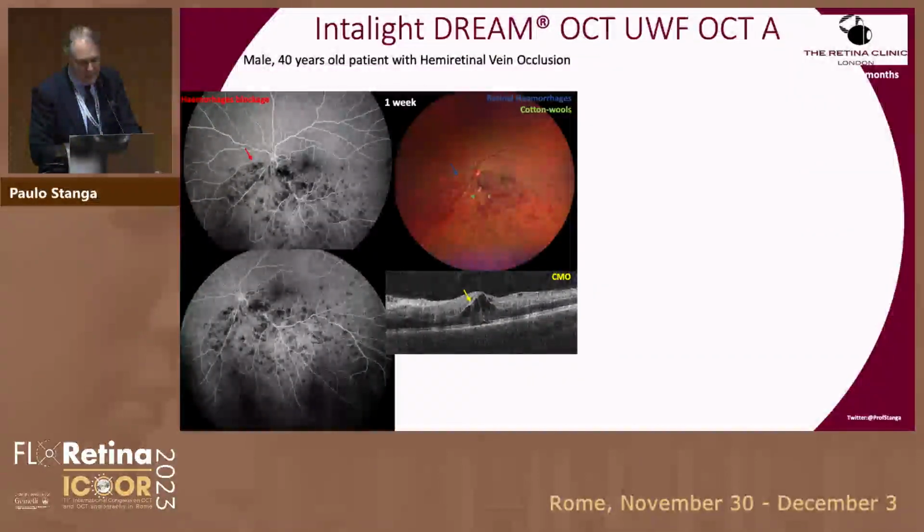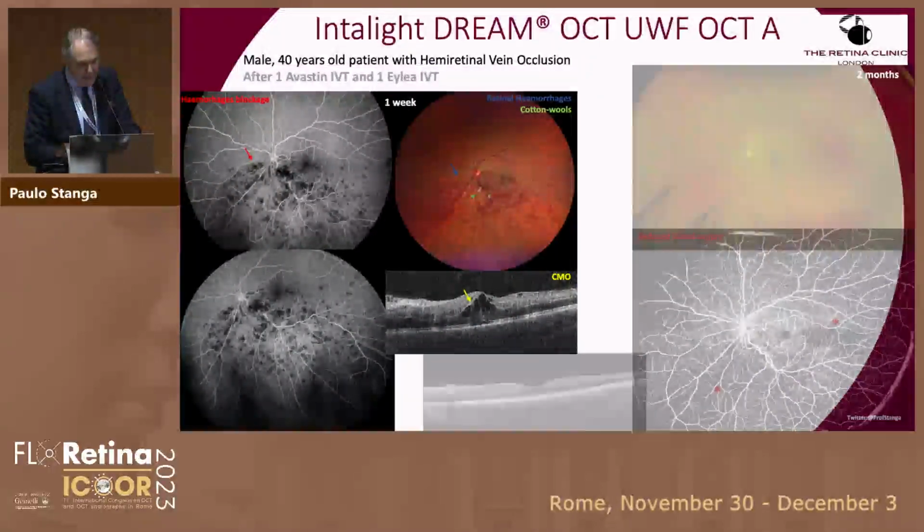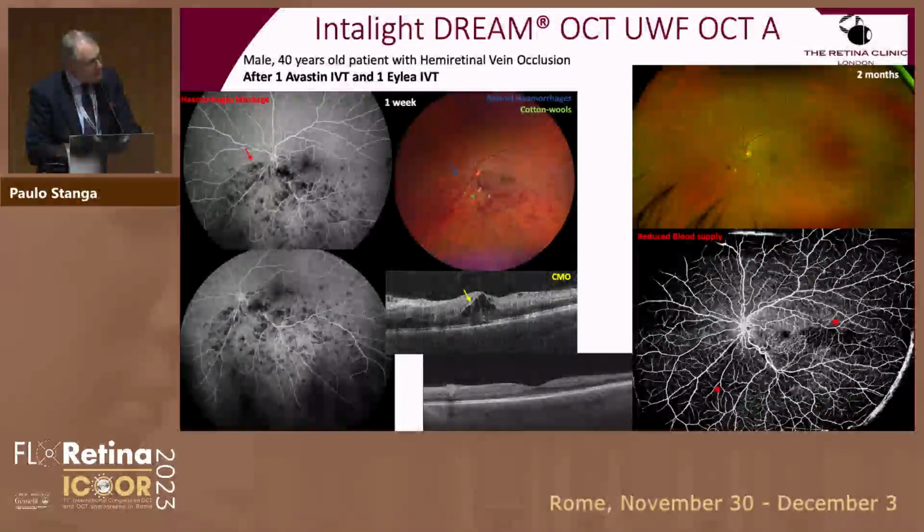And here you can see a patient that underwent fundus fluorescein angiography. This is Heidelberg technology, the presence of macular edema, and this is ultra-widefield OCT angiography, so you can compare the results and how easily you can see the areas of non-perfusion in a non-invasive way. This is a single scan image and not a montage. That's 130 degrees. So this is how we benefit from this technology in real life.